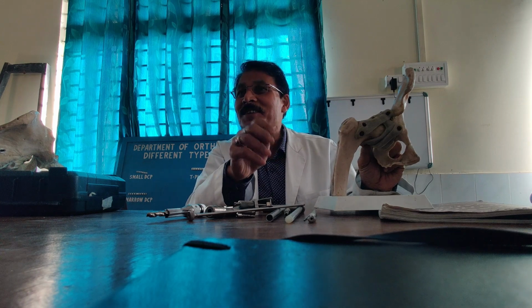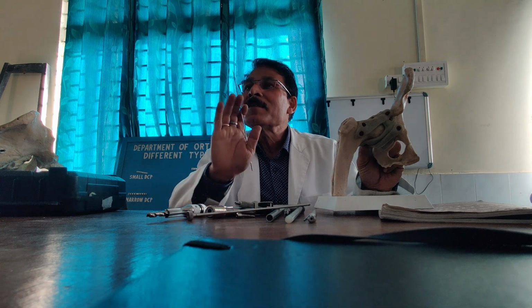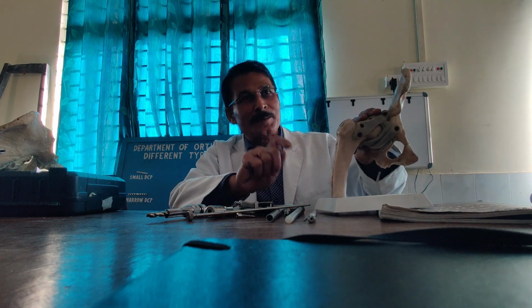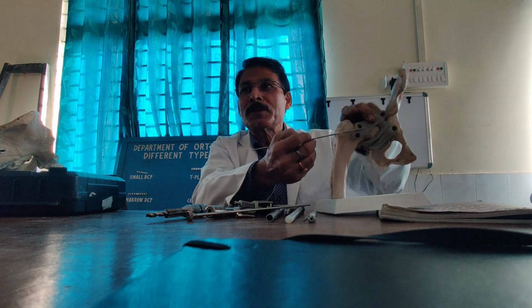Now how much plate am I supposed to give? This is more ideal situation, because the angle, are you getting my point? Yes, sir. So here we are going to fix 135 degree. But ideally, I am supposed to place the guide wire in the center AP and in the center lateral view. So this is called bull's eye. So I am getting a hit here.